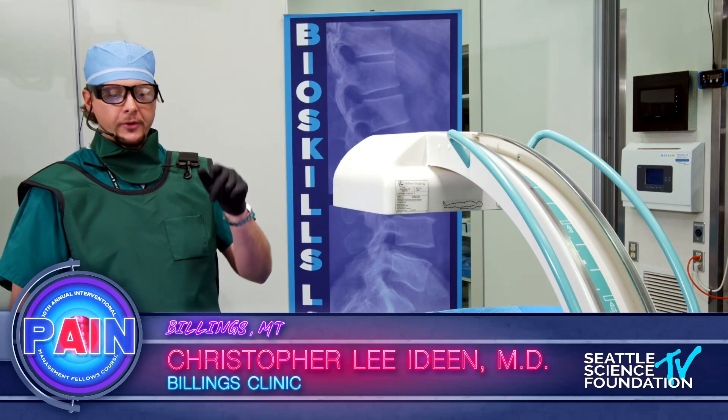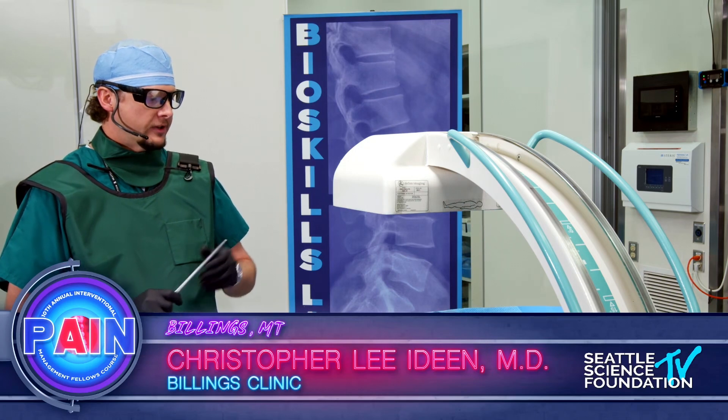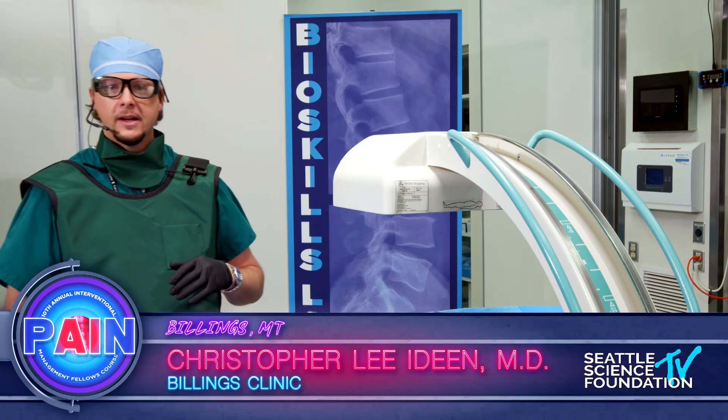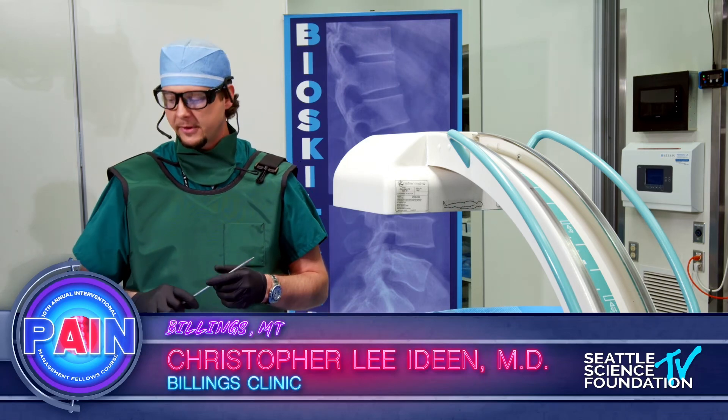I'm going to start off with a stimulator trial setup, and then Pradeek's going to come in and do more of the permanent installation process. We've got Eric and Teresa from Boston Scientific and Medtronic, respectively, with us.